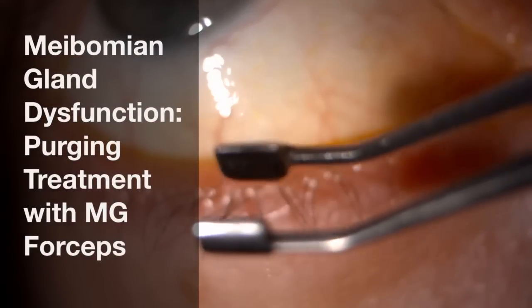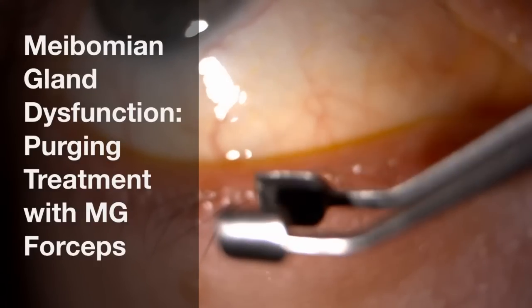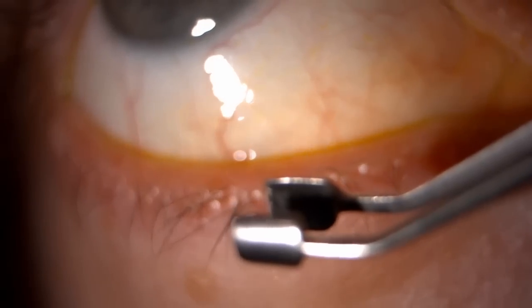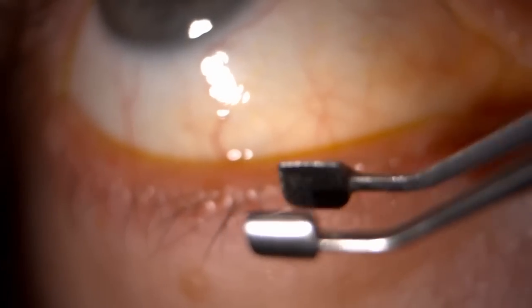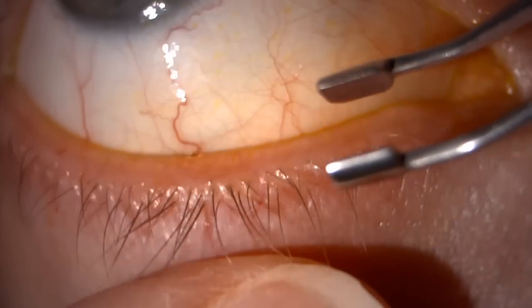We use meibomian gland forceps both to help diagnose the underlying condition and therapeutically to treat it by purging out the contents of the blocked glands.